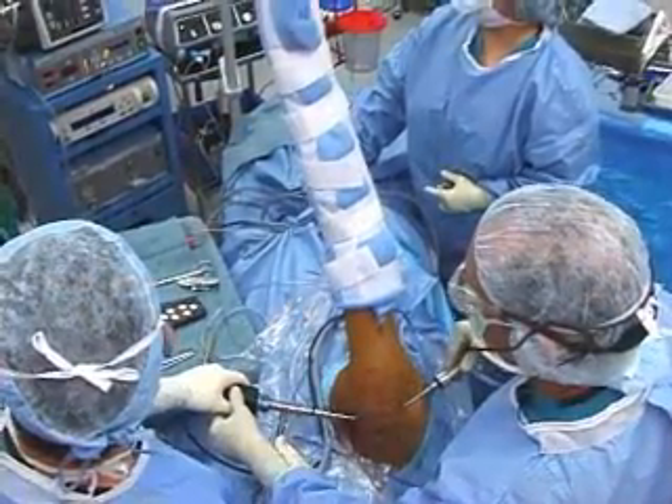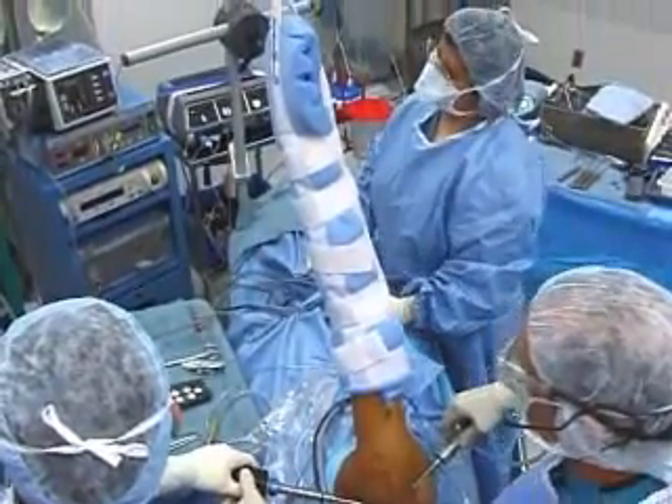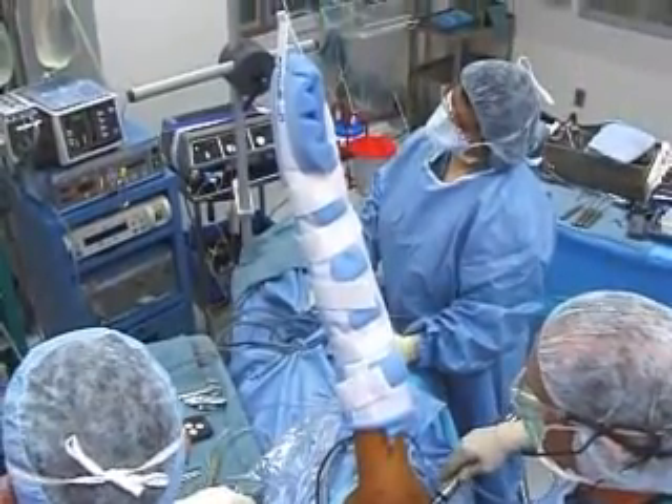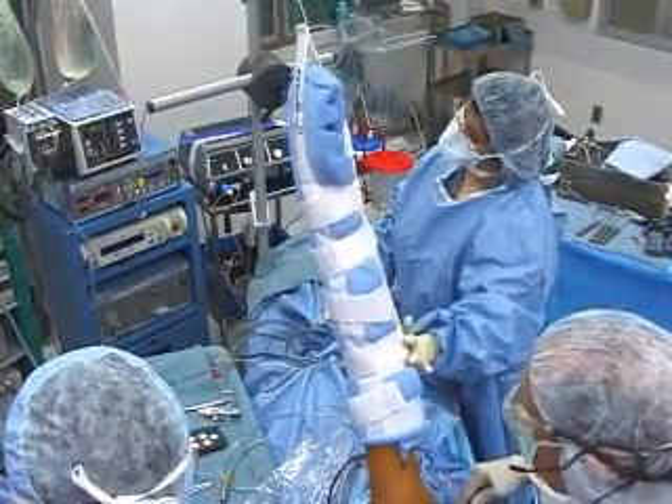We use a 70 degree abduction position with about 10 degrees of forward flexion, so the arm is just a little bit in front of the body and up about 70 degrees. The reason we go forward with the arm is because we always tilt the patient on the table backwards just a little bit, so the balance between the arm being forward and the patient tilted back gives us a nice stable position.